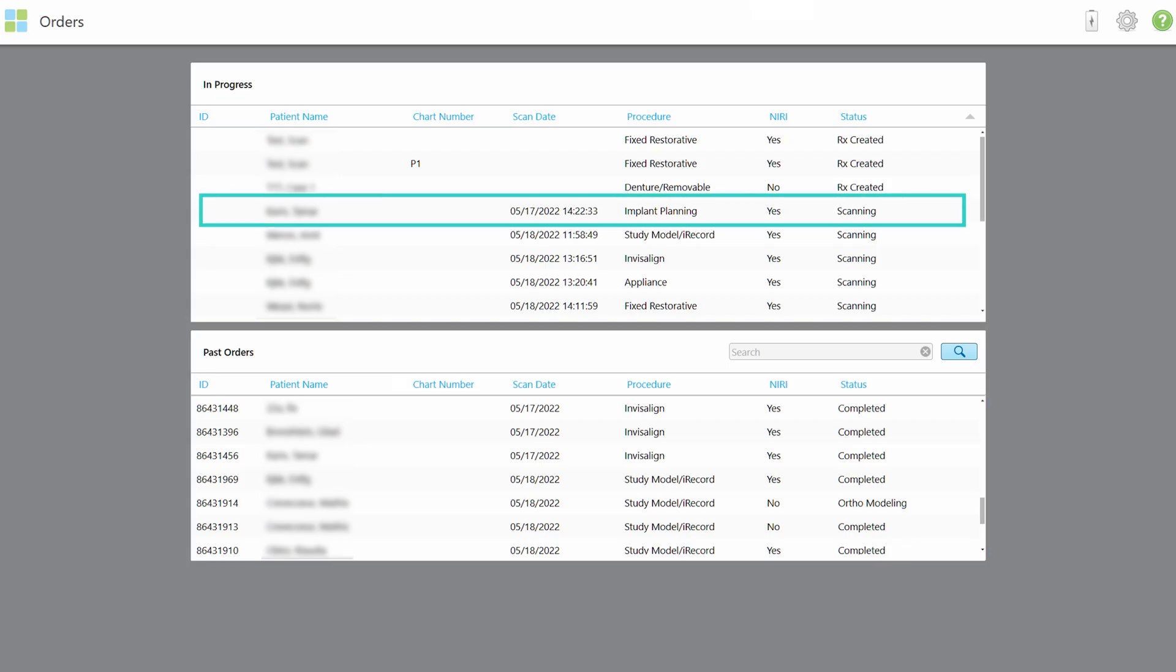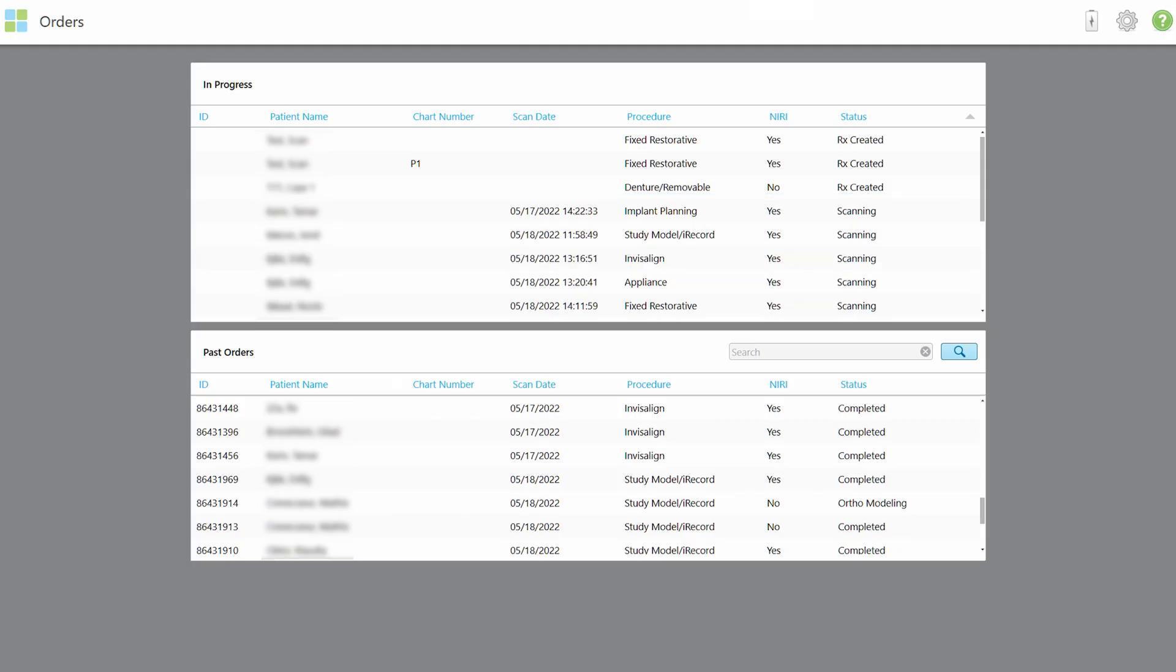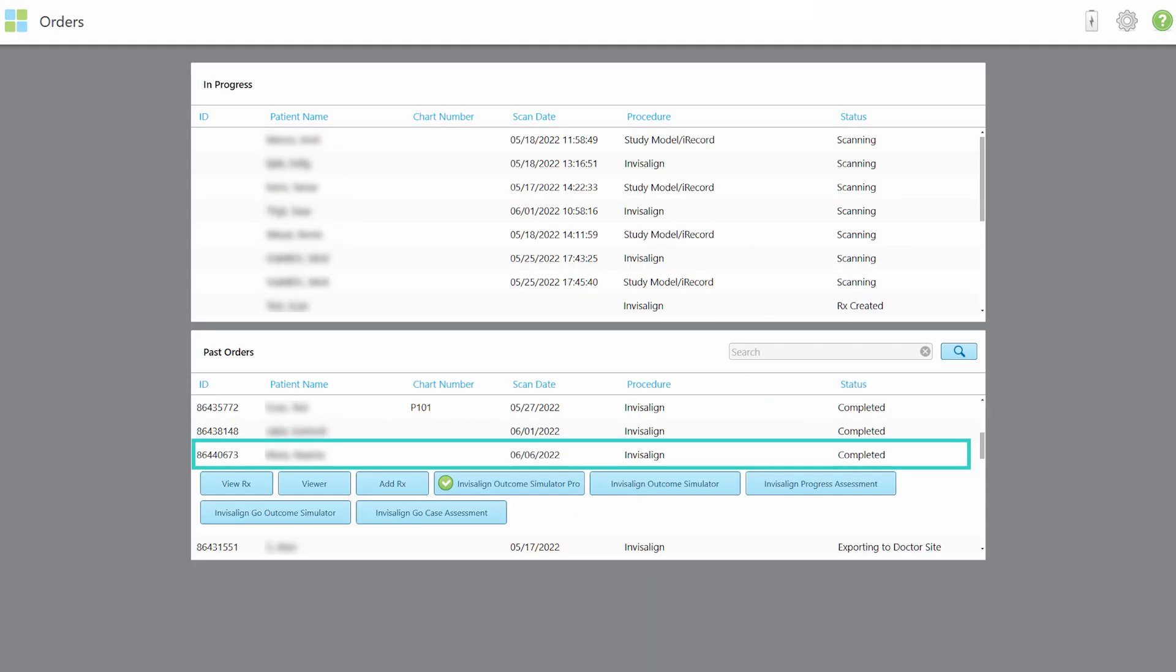Tap on an order in the In Progress pane to view the Rx details, create a new scan, view current scans, or delete the order. Tap on an order in the Past Orders pane to view the scan, add a new prescription for this order, and more.